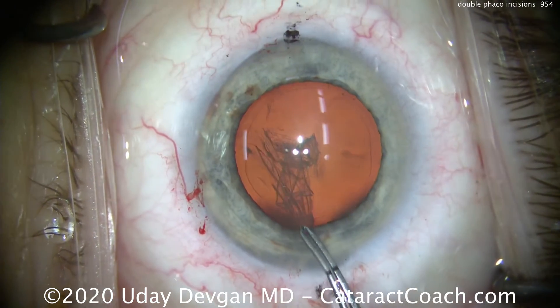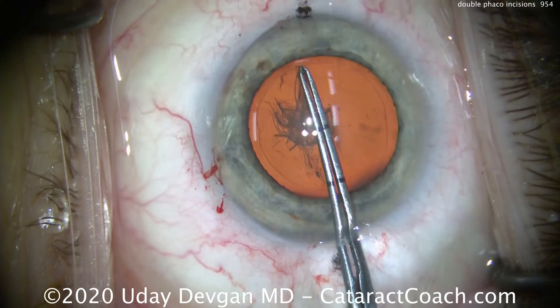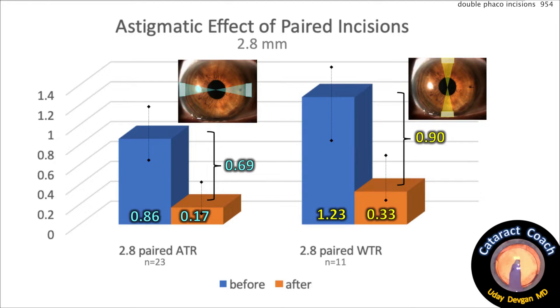We'll finish up the case — here's the capsulorrhexis, which goes beautifully. In a small study we did, we saw that paired incisions against the rule, steep at 180 degrees, cause about 0.7 diopters of flattening. The same type of incisions — again 2.8 millimeters wide — at the 90-degree or with-the-rule meridian cause about one diopter of flattening.